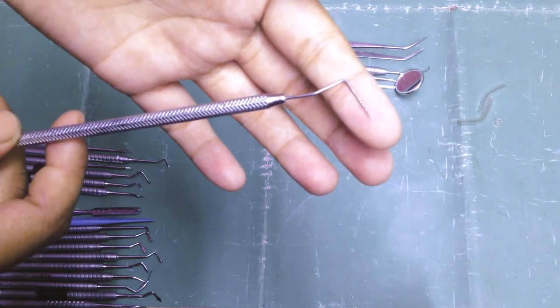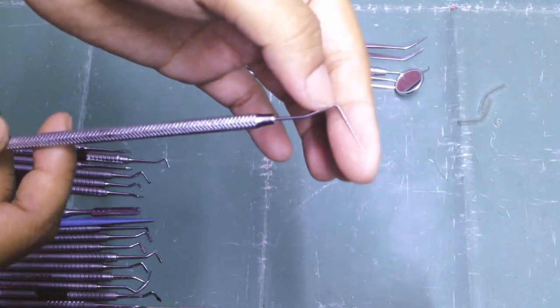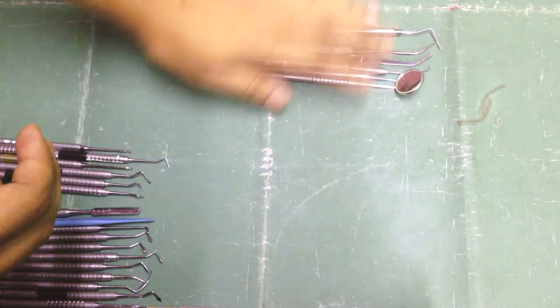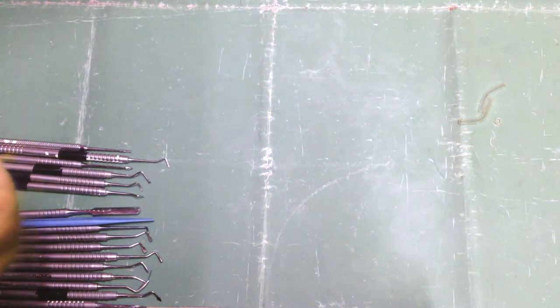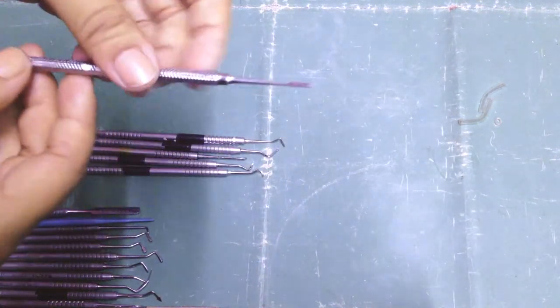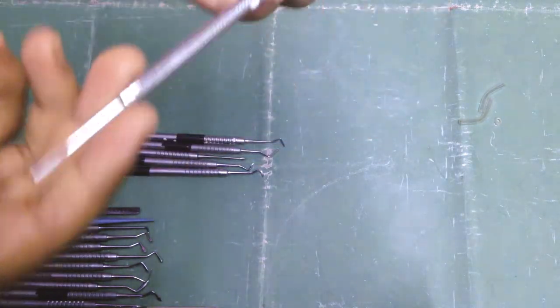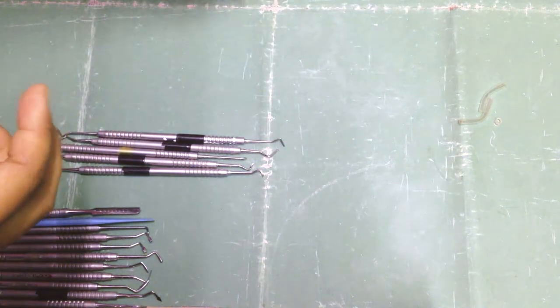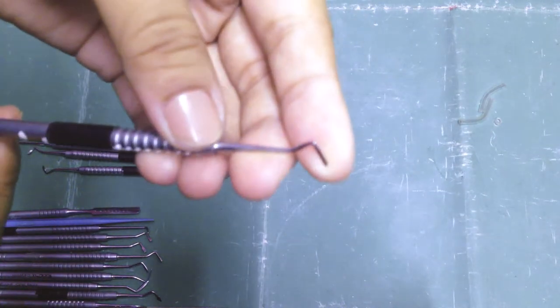As you can see, some markings. So these are diagnostic instruments. Now let's move on to hand cutting instruments. Let's start with chisel. This is a straight chisel. Then we have enamel hatchet, and I will hatch it.